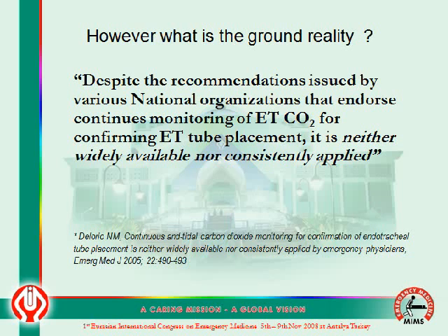There was a study conducted in the US among emergency physicians in hospitals, and it concluded that despite the recommendations issued by various national organizations that endorse continuous monitoring of end-tidal carbon dioxide for confirming ET tube placement, it is neither widely available nor consistently applied.